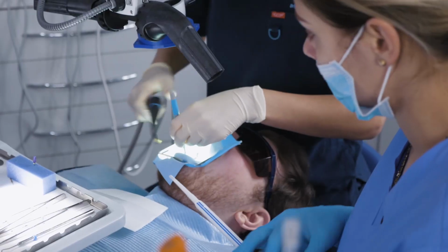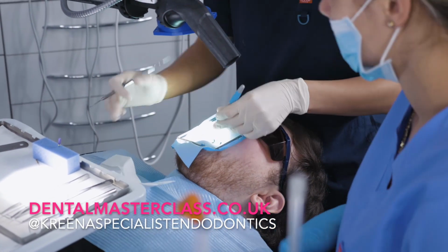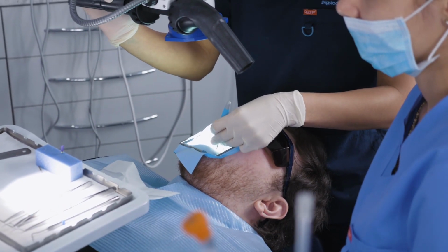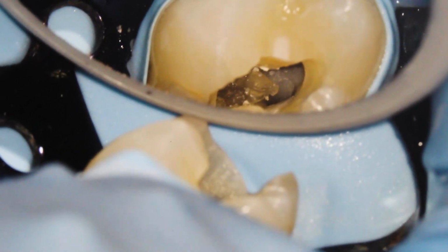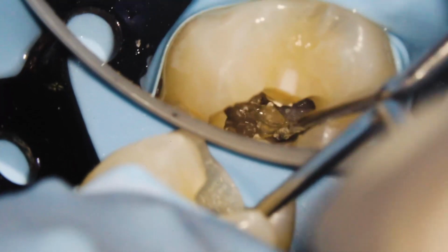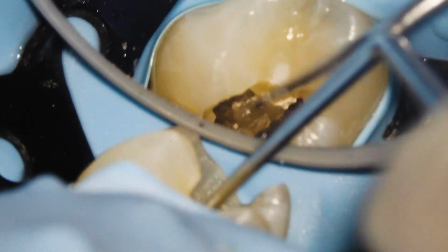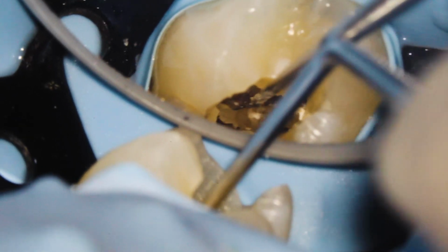And again, then I'm just going to have a little look, see where we are. In this case, we can see here a pulp stone in the canal, which we can see just here. So you can see it's actually moving. So we can just tend to flick that out.